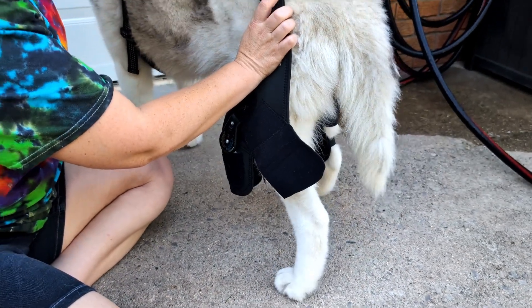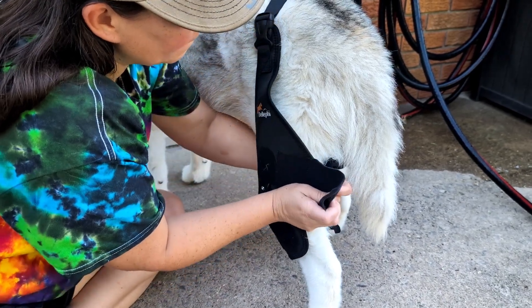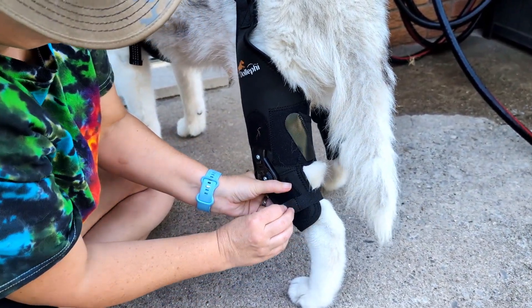You are going to wrap each of these around each knee and adjust them accordingly. They have the hook and loop, which makes it really easy to adjust. Once you have that adjusted, you're going to clip the back to the front. This not only helps hold everything into place, it also keeps everything nice and stable.